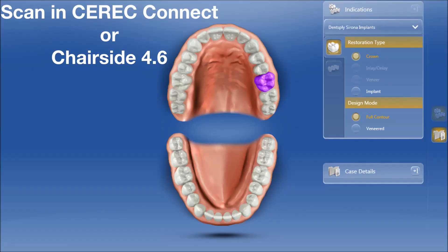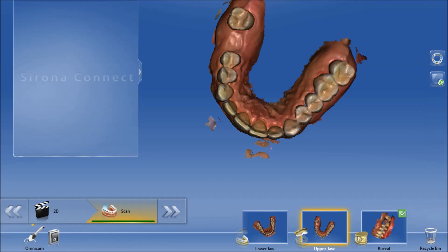When your patient is there, the only data you really need to collect from them is an optical scan and a CBCT. If you're doing an optical scan with CEREC, you can either open CEREC Connect, or if you have Chairside 4.6 or later, you can scan in that. In CEREC Connect, we're going to make sure that we have Dentsply Sirona Implants as the laboratory selected, and then under Restoration Type, we're going to choose a crown. The next steps such as material are irrelevant — we just want to continue on to the imaging catalogs.